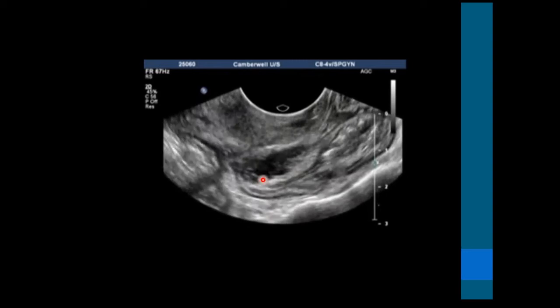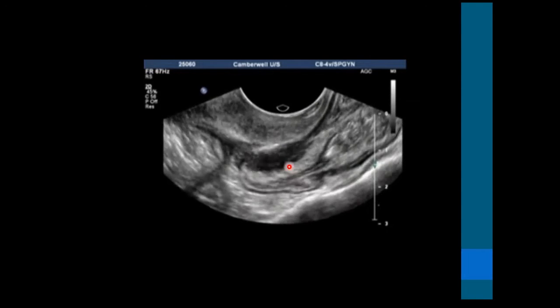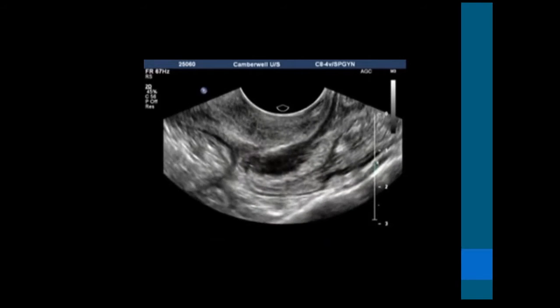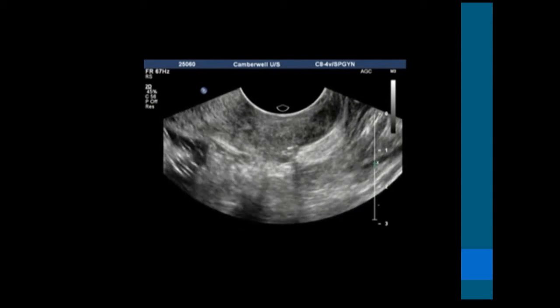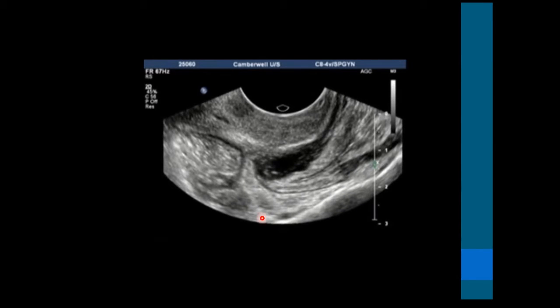Just again here, the bowel nodule stuck to the vaginal nodule, and there's usually a uterosacral ligament nodule in between, but that is sort of more advanced. That's the bowel nodule now being measured. And so it's not uncommon when you see a vaginal nodule to see the bowel stuck to it and infiltration into the bowel wall at the same time. So this is a submucosa layer overlying the muscularis layer, and that looks intact.